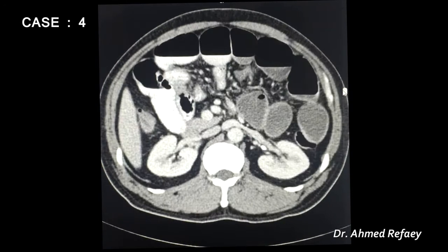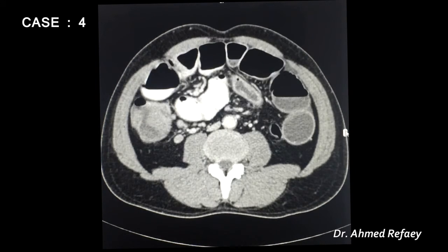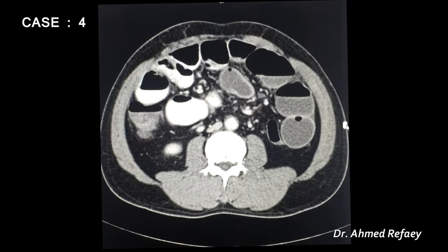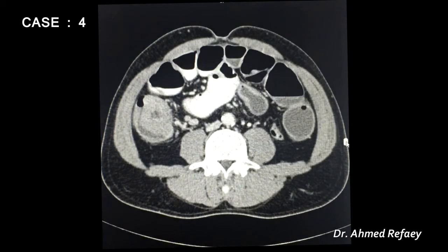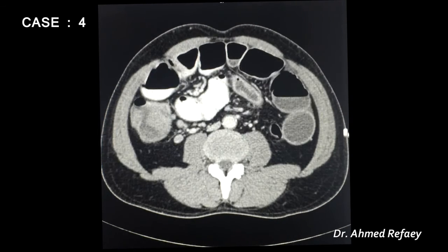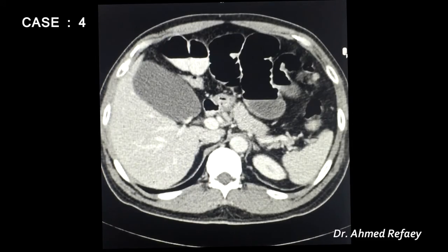Marked dilatation of the small bowel is appreciated with valvulae conniventes. Tracing distally from the ascending colon toward the cecum, a soft tissue mass is identified in the cecum with multiple regional lymph node enlargements. This tumor extends to the terminal ileum and is the cause of the small intestinal obstruction. The diagnosis is a cecal tumor causing marked dilatation of the small bowel.